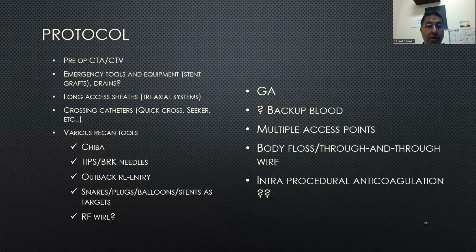Crossing catheters, quick cross, Seeker. These devices are mandatory.